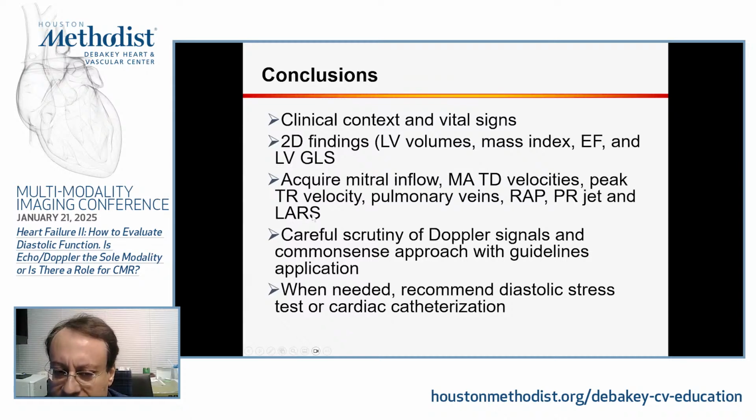Before I rely on any signals, I ask myself, is it satisfactory or not? I apply a common sense approach, as in the examples we've gone through. If needed, proceed to a diastolic stress test or cardiac catheterization.